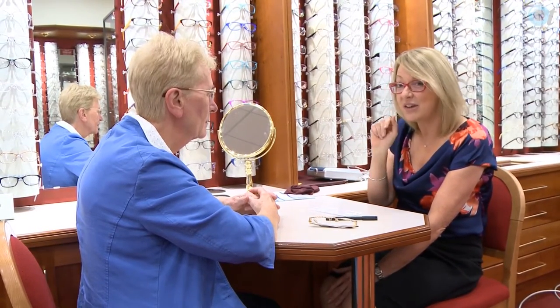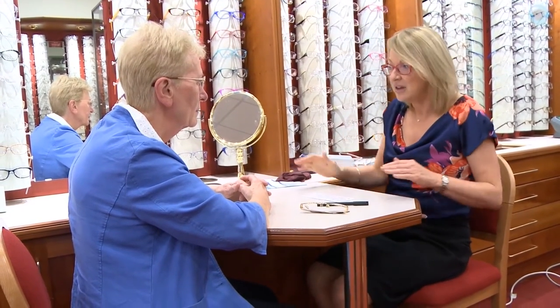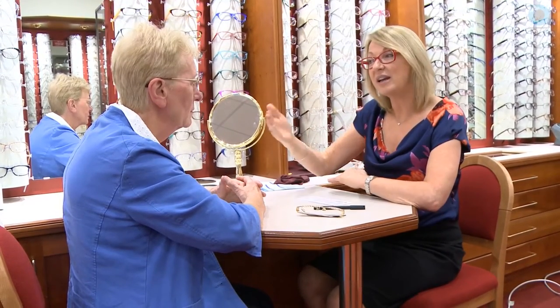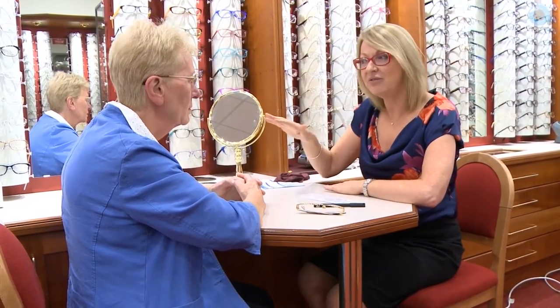So if you look in this side for me — that's four above — and that side for me — that's six above. So the frame's sitting straight on the patient, so I would actually set the heights at four and six above. When I look at the patient, if they're not quite even, I would check the fit of the frame first to see if the frame's uneven or if one eye's slightly higher than the other.